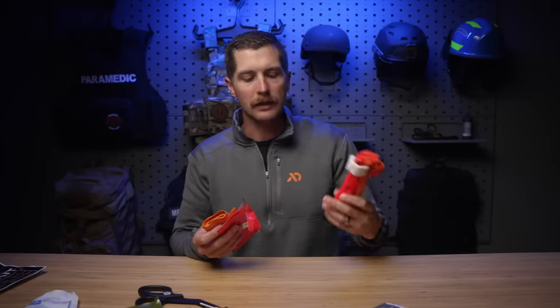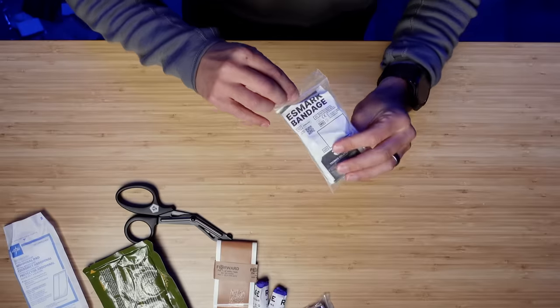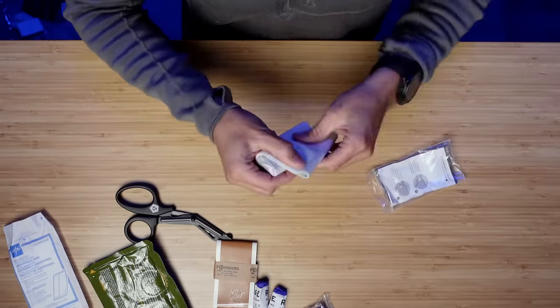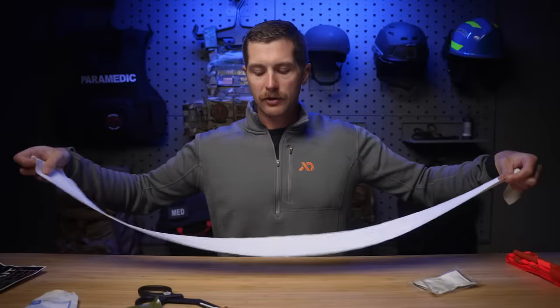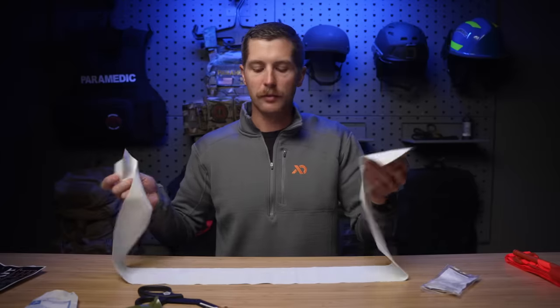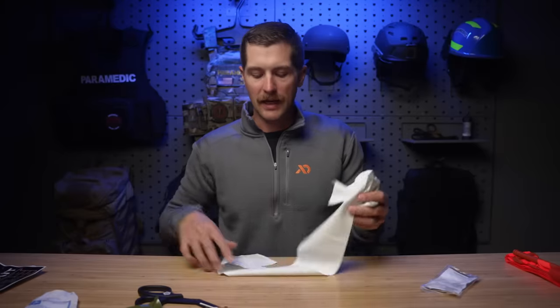Of course this kit comes with an actual recommended tourniquet, so this is just a backup. Next up, we have a product I have actually never seen before — this is the Esmark bandage, and it's very similar to the SWAT-T. It's an elastic bandage. They say it's not a tourniquet, so don't use it as one. It can be used to reinforce a pressure bandage, to create a tighter seal around a wound, or to wrap in wound packing. On the last wrap you can just pull up an end and tuck it in to secure it — you don't necessarily need tape. I'm not sure if I would have put this in the kit myself, but it is an addition, and this is more than a minimalist kit, so this could be very useful.